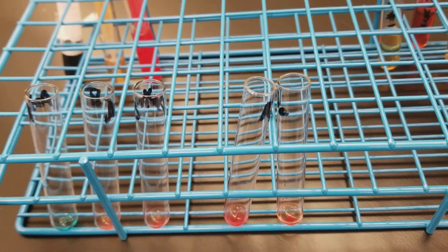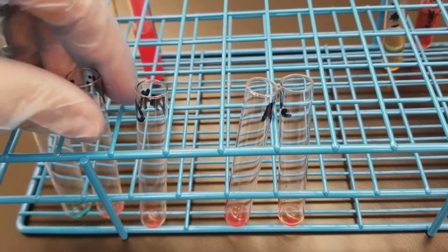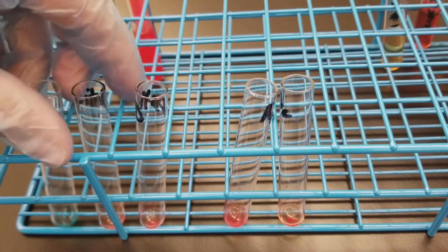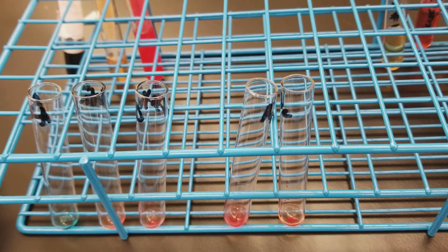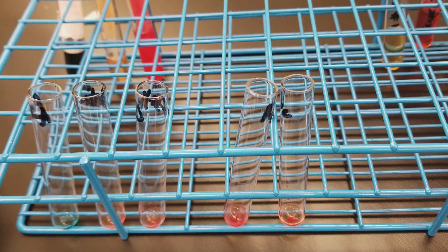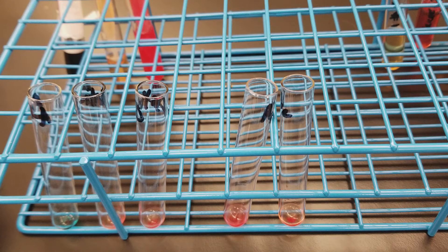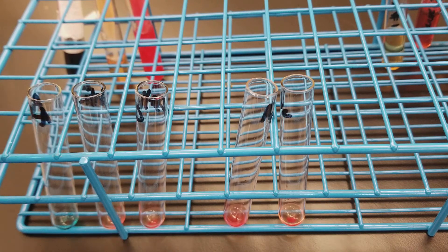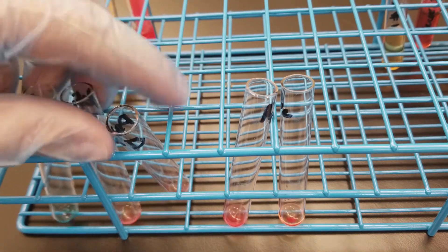Hi everyone. Today we're going to be doing a cross match. I lost all the plasma that I had for the patient that we did with the antibody screen and antibody identification panel, so I ended up having to do a new patient.